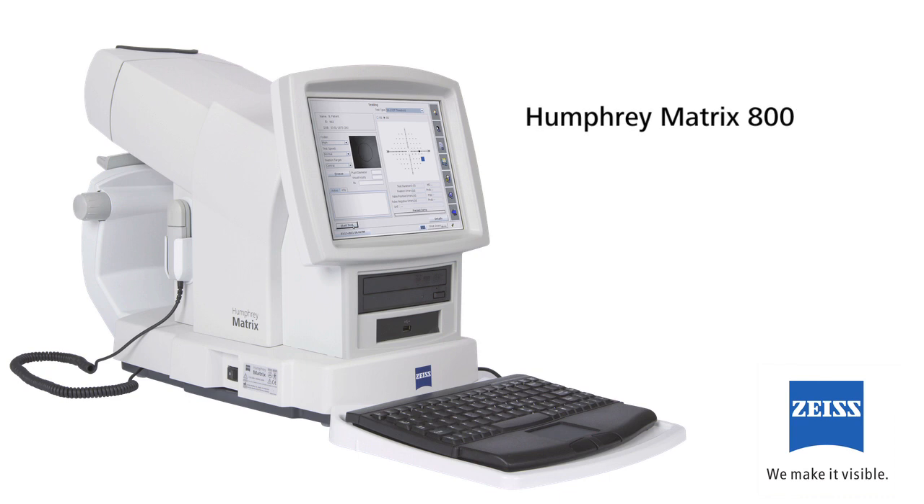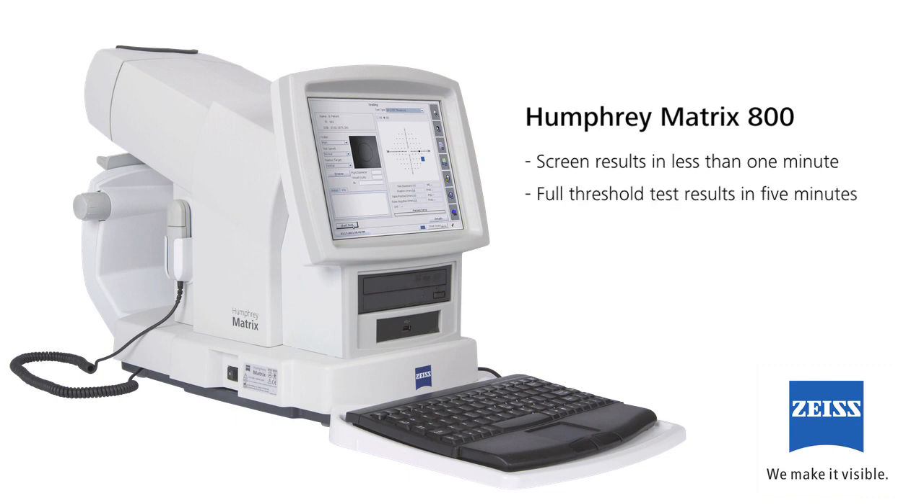Thank you for purchasing the Zeiss Humphrey Matrix 800 visual field instrument featuring frequency doubling technology. The Humphrey Matrix 800 provides accurate and reliable screening results in approximately less than one minute and full threshold test results in five minutes per eye. The instrument incorporates a large age normative database to ensure the accuracy and reliability of your tests.